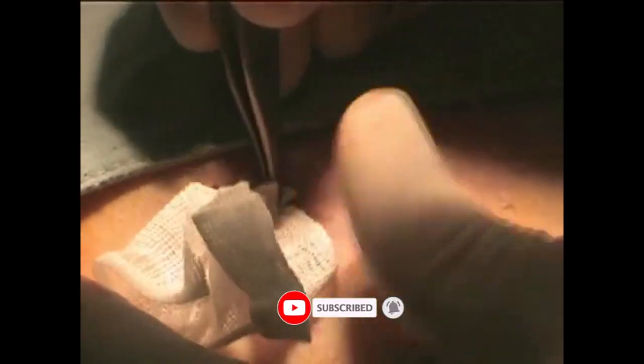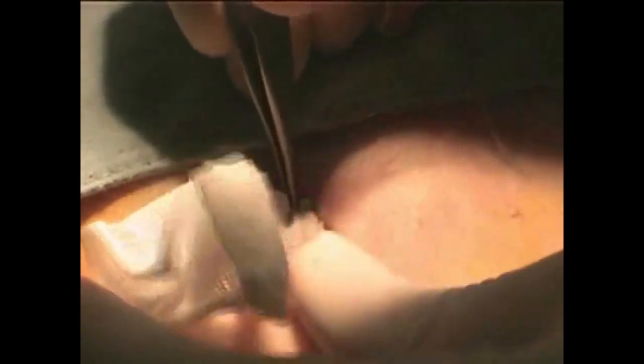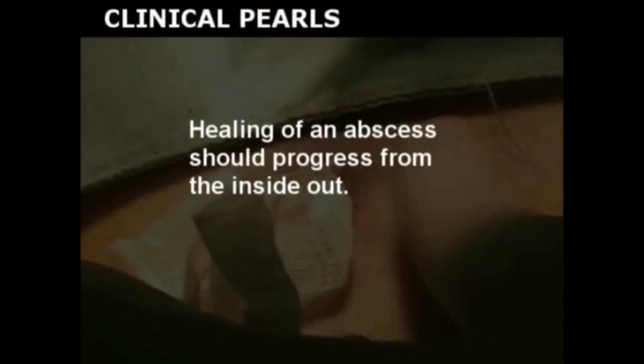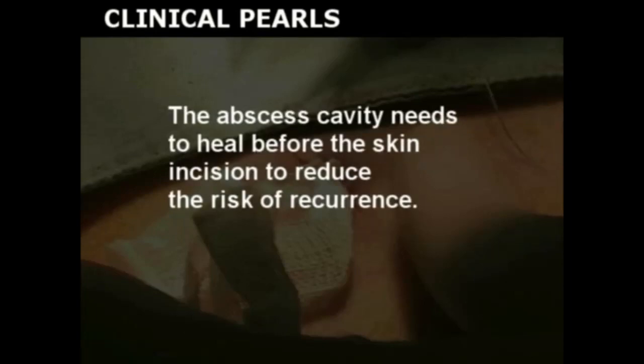Do not pack the wound tightly, as this does not improve outcomes. Apply an ointment over the wound to prevent packing gauze from sticking to the overlying dressing, which can lead to accidental removal of the packing when the dressing is changed. Healing of an abscess should progress from the inside out. The abscess cavity needs to heal before the skin incision to reduce the risk of recurrence.